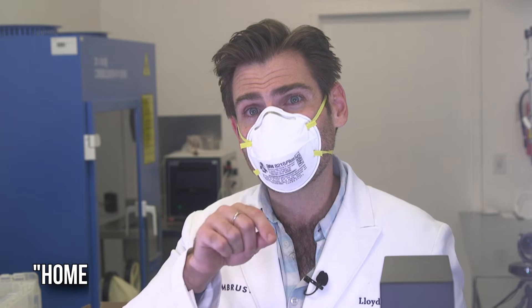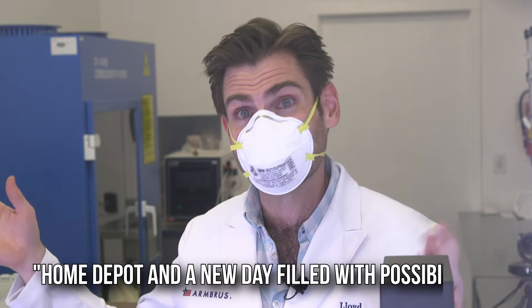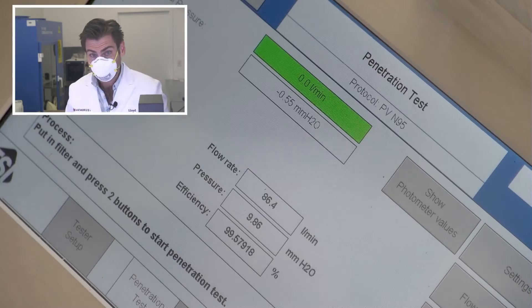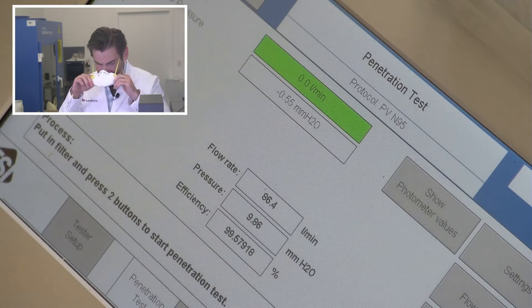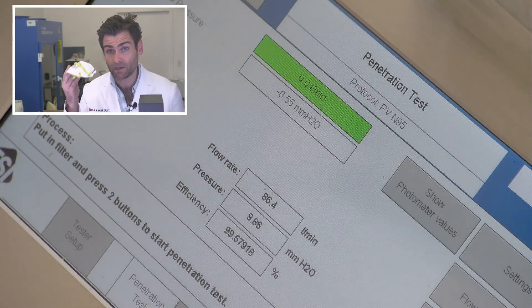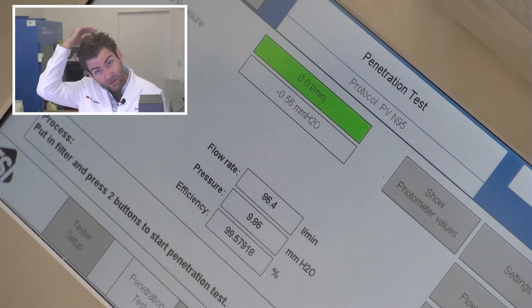Wow, this mask smells like Home Depot and a new day filled with possibilities. Anyway, I've got a post hole digger and I'm making fence posts today. The results are in: 99.57% filtration efficiency and 98.6 pascals resistance — the best 3M N95 we've had on the machine all day, and it has been a long day.